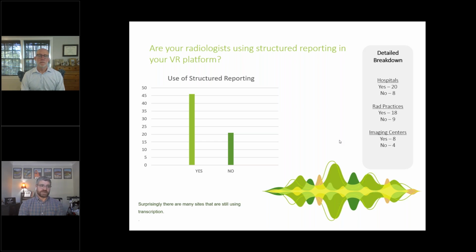And then the radiologist either can sign in real time or send to an editor. And if they send to an editor and the editor doesn't have to make any edits whatsoever, voice recognition got it perfect, the editor just lets it go. It's kind of just sitting there in a holding tank. Then if the editor did have to make any type of meaningful change, other than move a period around or take some double spaces out or something like that, they send it back to the radiologist for a quick approval. And all that happens super fast.